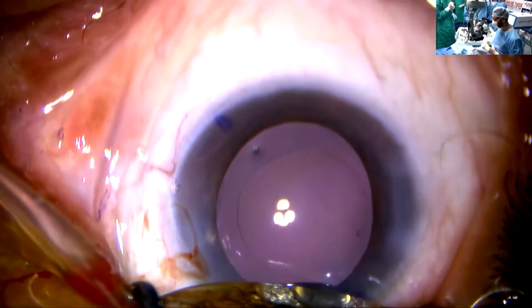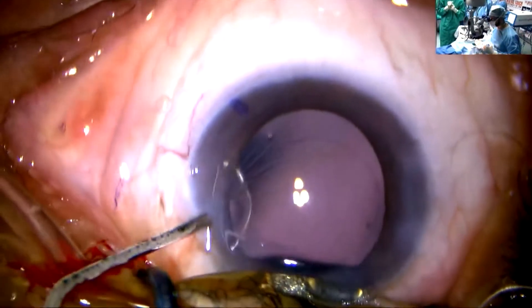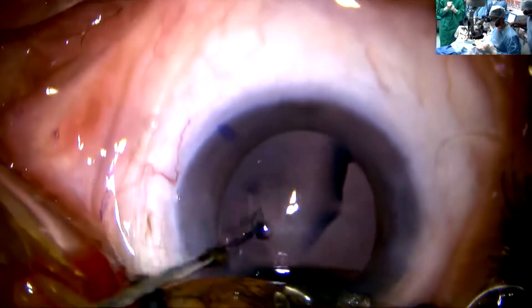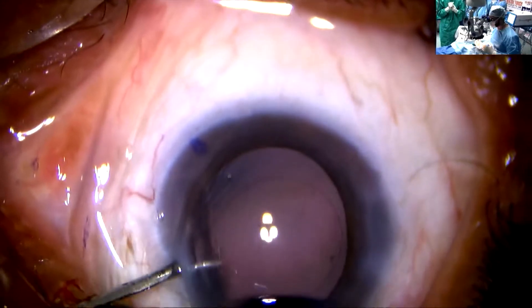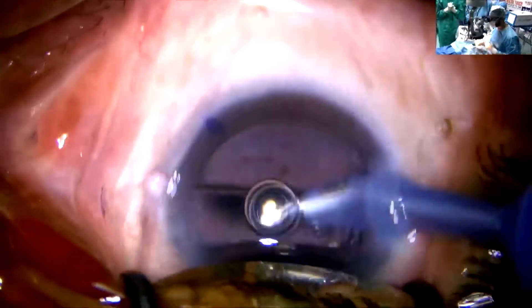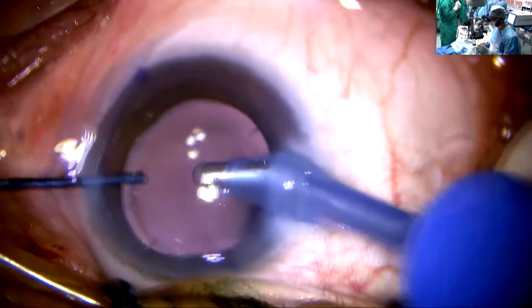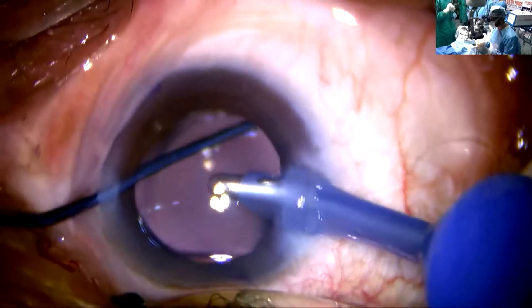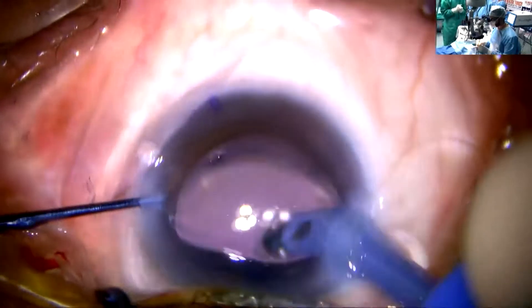I'll be hydro-implanting this lens using a BSS jet with a 26-gauge cannula. The advantage of the double haptic is that we don't have to leave it under-shot by three to five degrees — we can exactly place it at the desired axis.